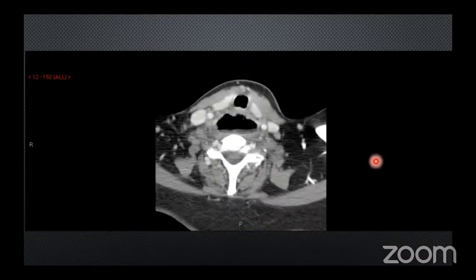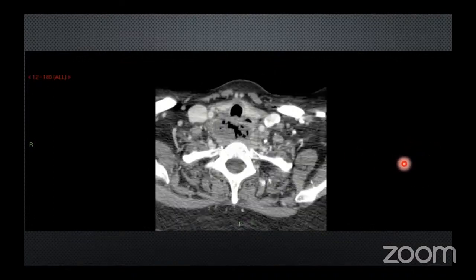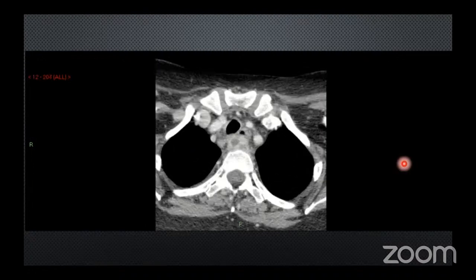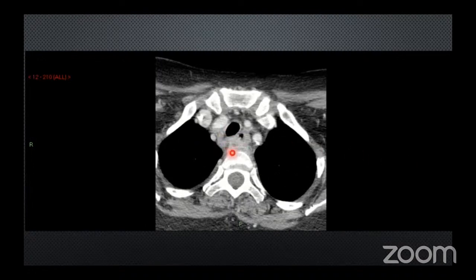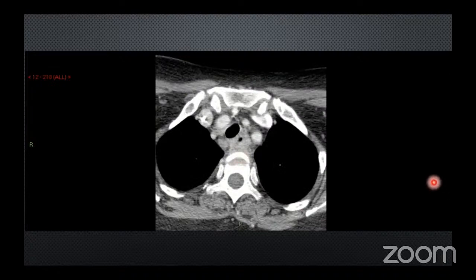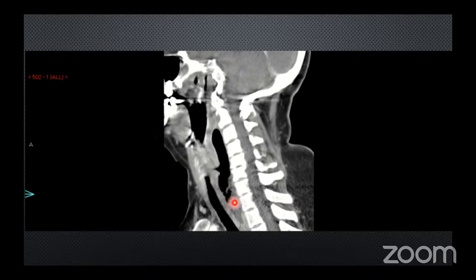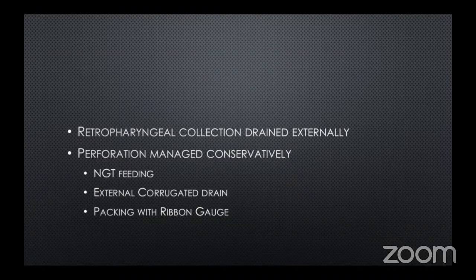So she had a CT scan to mainly look for extension to the chest, which thankfully she just about did not have. So she was managed with an external approach. You can see the extent of the fluid collection, which was getting worse here. It was an external approach, and she did pretty well.